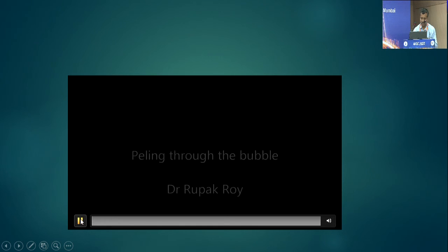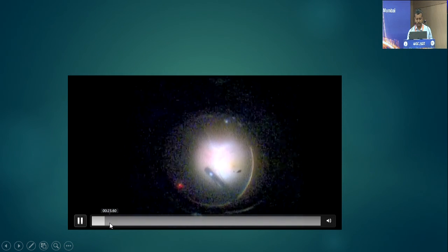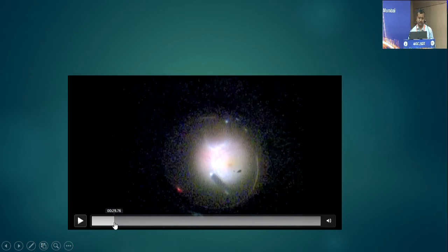So I'll share two videos to highlight two techniques. Basically, one is PFCL assisted and one is without PFCL. So this is the first video. This is an older video. You can see first, obviously, the steps remain the same: you do a complete vitrectomy.